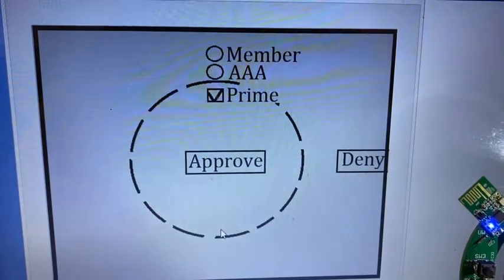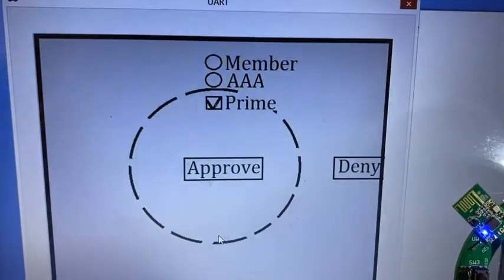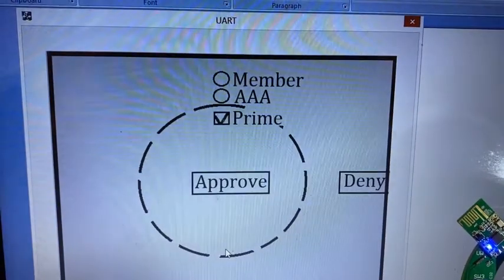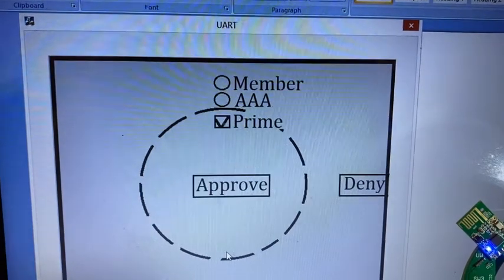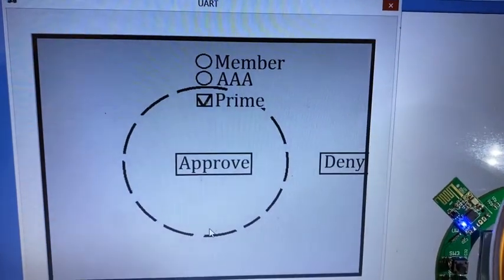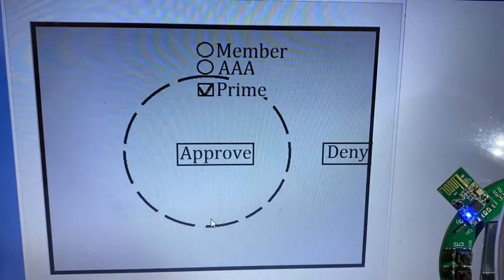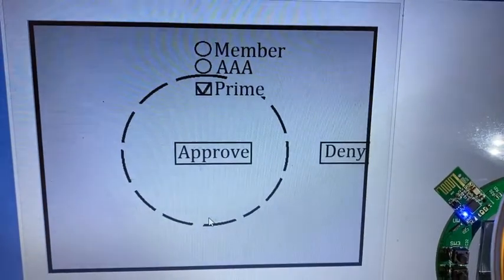So this is a very novel, very revolutionary way of using your eyes as a pointing device that we propose, and we actually received a patent on this particular technology, and we intend to build our contact lens employing this technique.